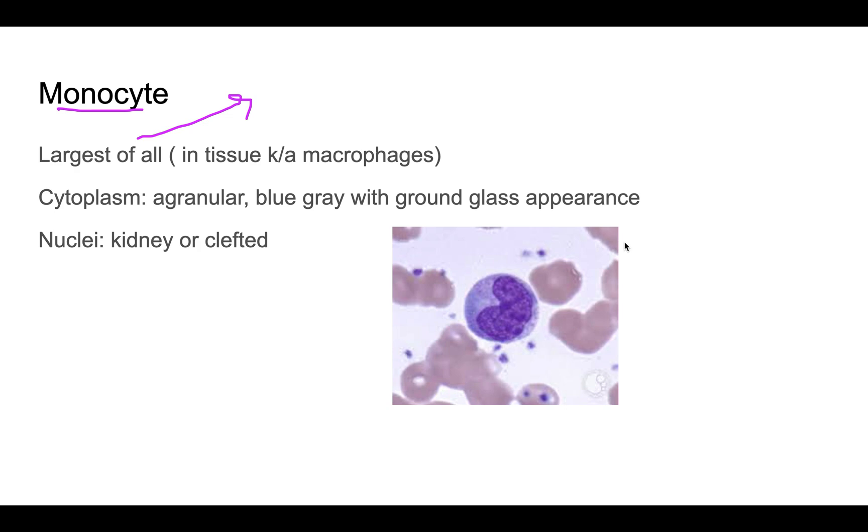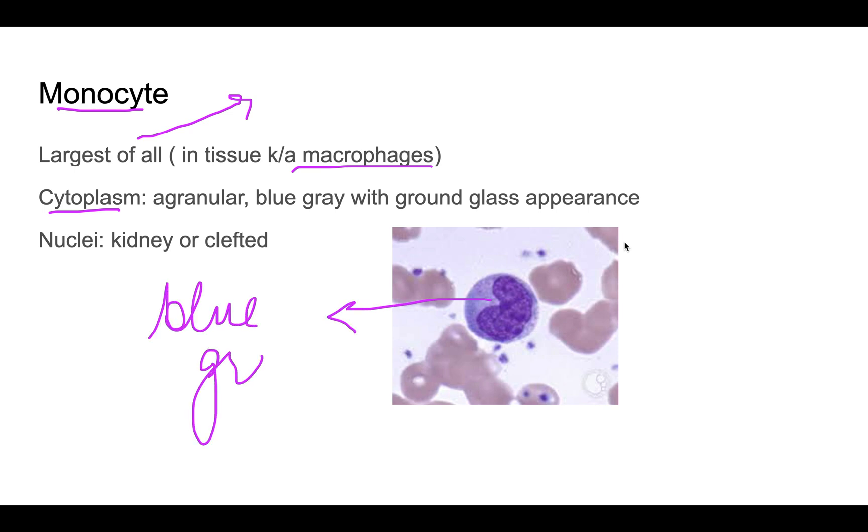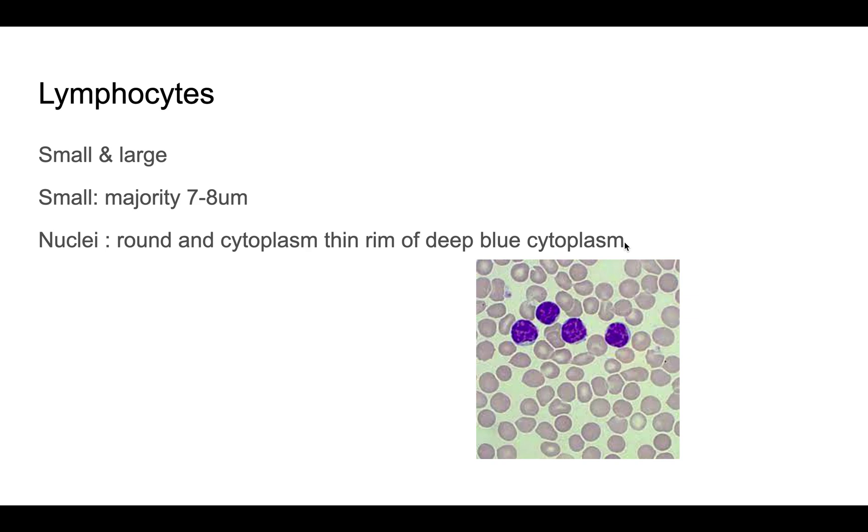The monocyte is the largest of all leukocytes. In tissues, monocytes are called macrophages. Since it is an agranulocyte, the cytoplasm is agranular. The cytoplasm color is blue-gray or slate-gray with a ground-glass appearance. The nucleus is kidney-shaped or slightly clefted.